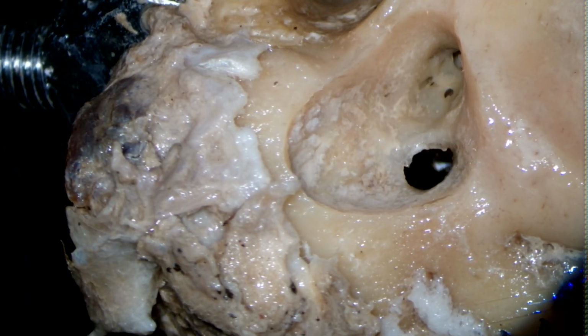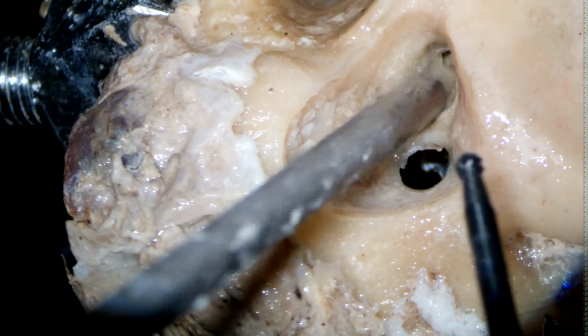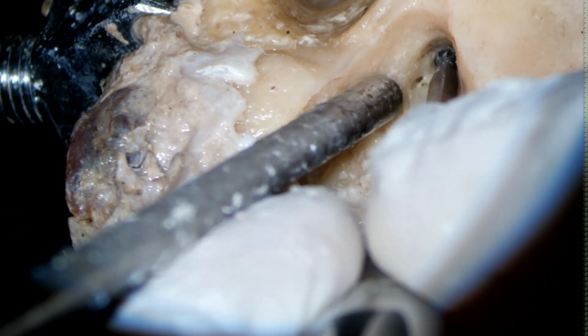Okay, so probably this is our antrum, and let me see if I can see the aditus and enlarge it, right?